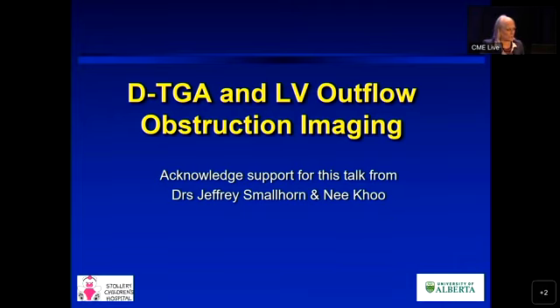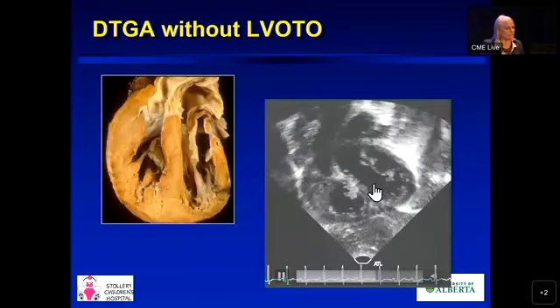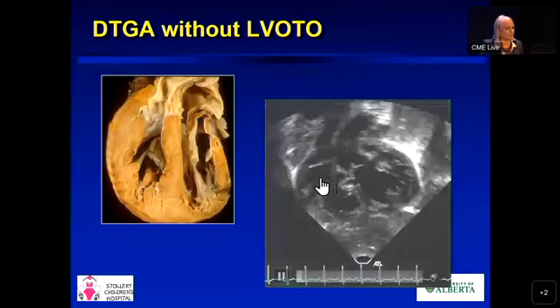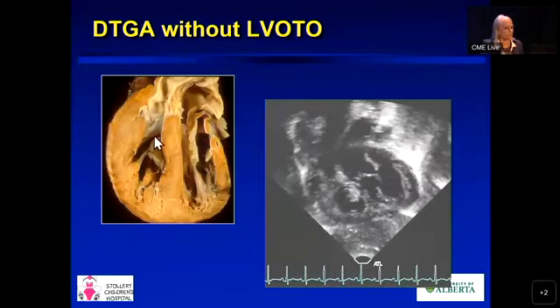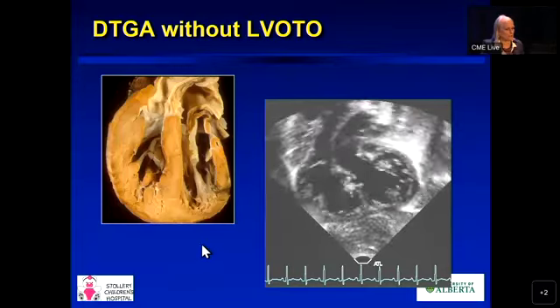That's a fetal case, of course, but not necessarily about this topic. So, of course, we love to see a beautiful little left ventricular outflow tract and a great pulmonary valve and a normal transposition, even with a ventricular septal defect. As you can see here, the aortic valve is quite normal, and the pathologic sample from many years ago looks the same. So there's no outflow obstruction.